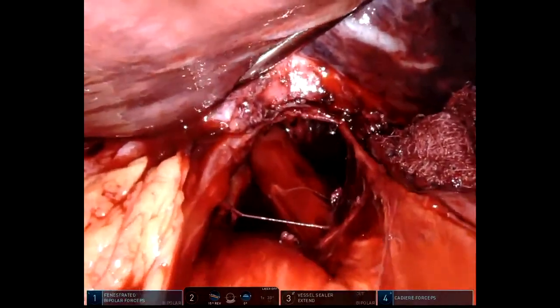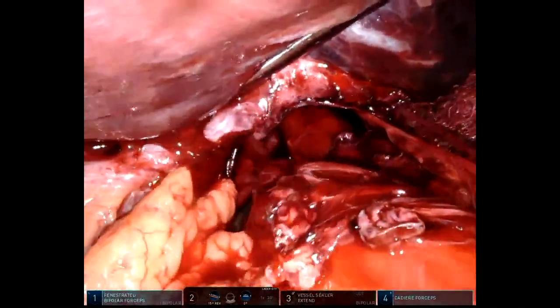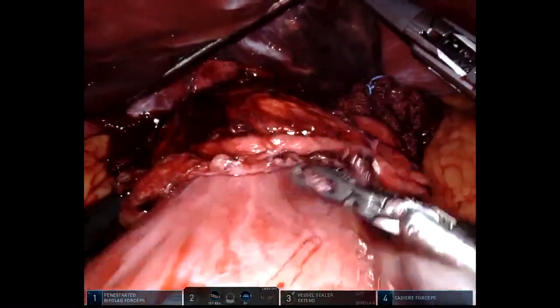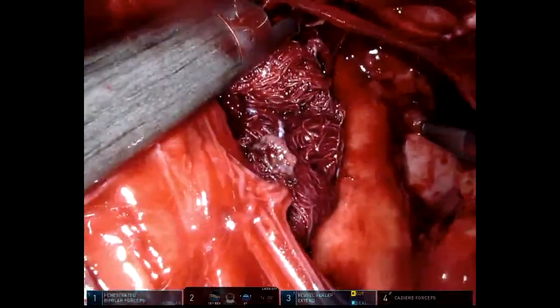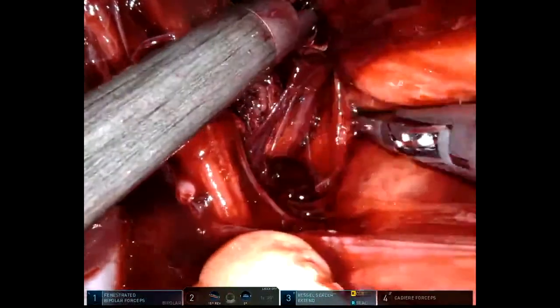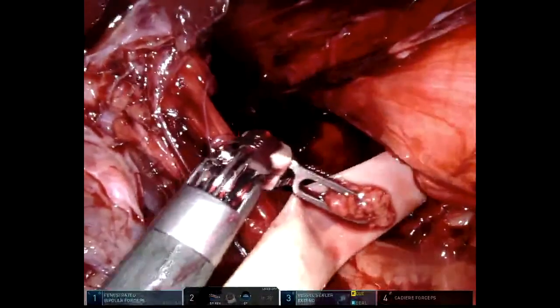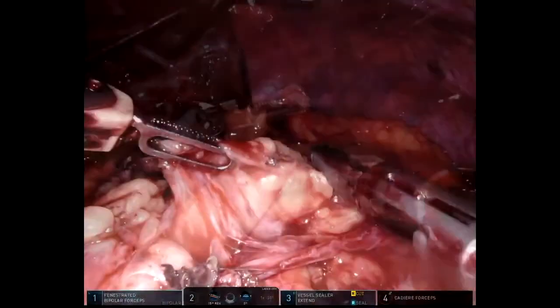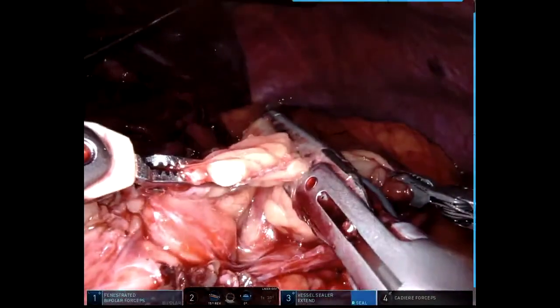We see anesthesia trying to advance the bougie. The bougie was successfully placed into the stomach for decompression. In order to visualize the constraint, further dissection takes place along the hernia sac towards the left crus.